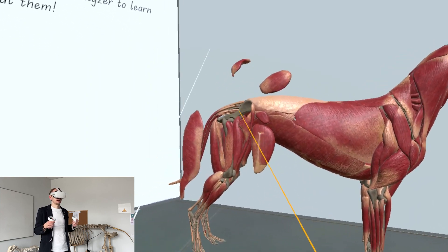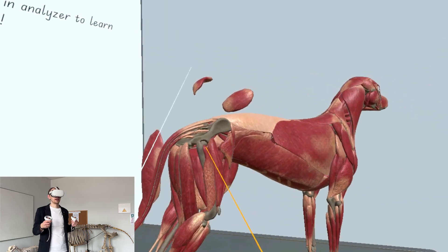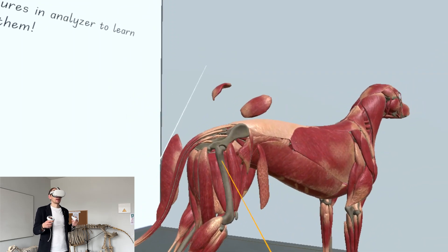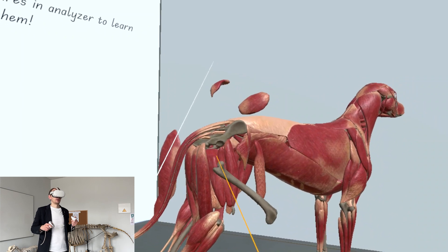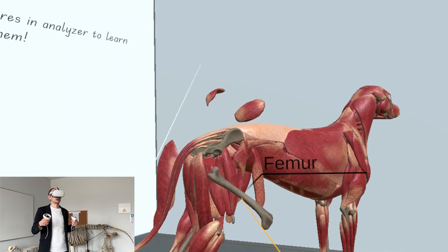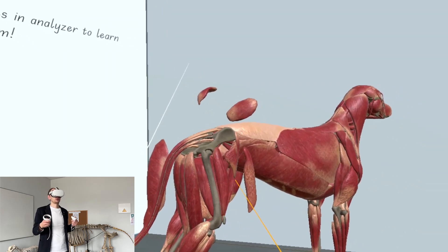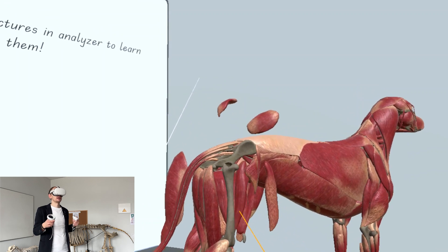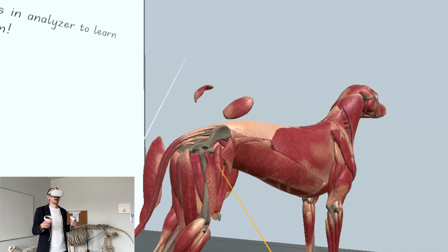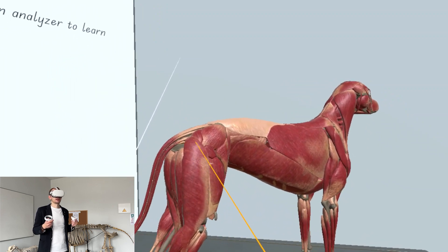We can rotate our dog closer to us, then rotate the leg, and we need to make an incision here. Once we've removed it completely, we need to stitch the vastus lateralis muscle, and that's how we perform this surgery.